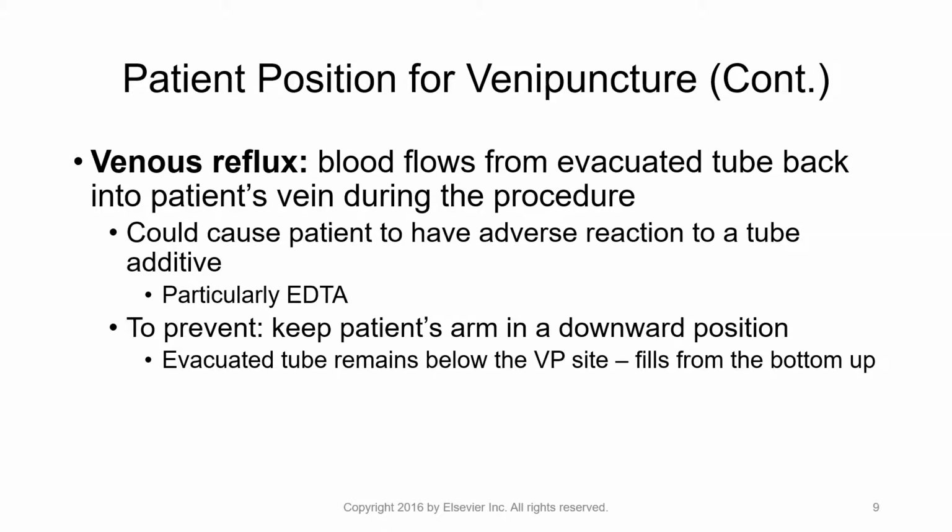This sort of contradicts my personal preference on venipuncture, which is to have my patients in the supine or semi-recumbent position. At least in semi-recumbent, we can put the arm in a downward position, but supine positions don't allow for this so well because the patient's arm is parallel to the floor, so the venipuncture apparatus is going to be angled a little bit upward. And that's okay.